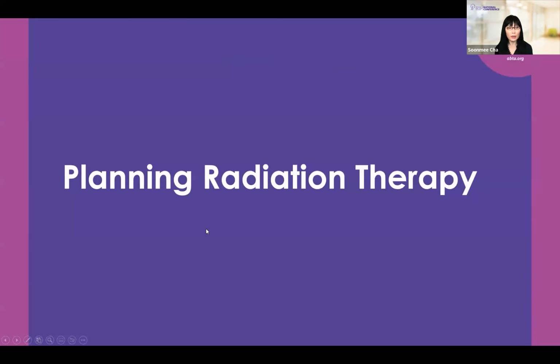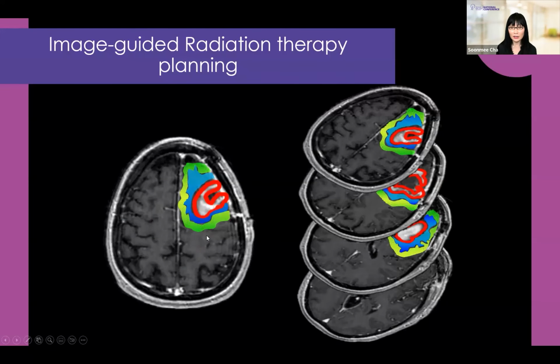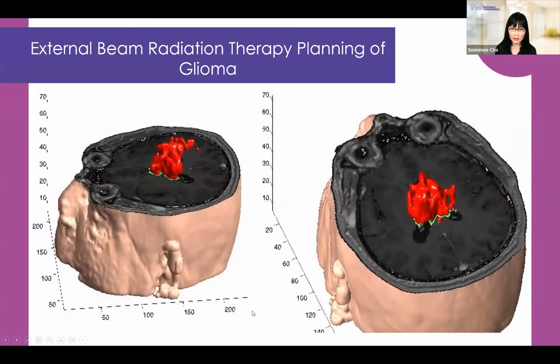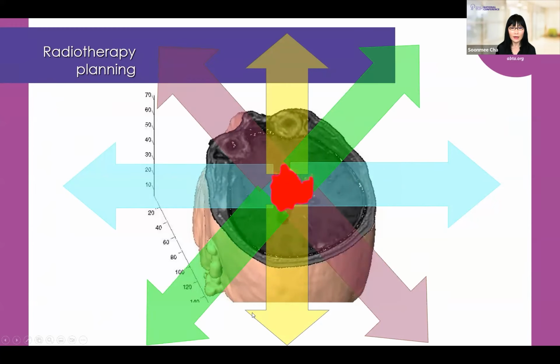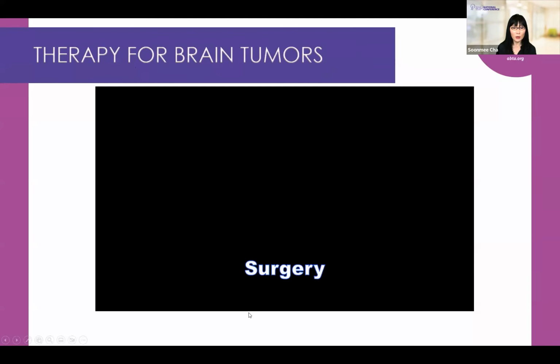And I think Dr. Mehta already beautifully talked about radiation therapy. Without imaging, planning for radiation therapy will not be as precise. It's either CT or MR based, and many new techniques are coming out, and almost all of these are sophisticated 3D rendering image based. So imaging is a critical part of your radiation therapy planning because of this advantage of providing amazing 3D imaging.